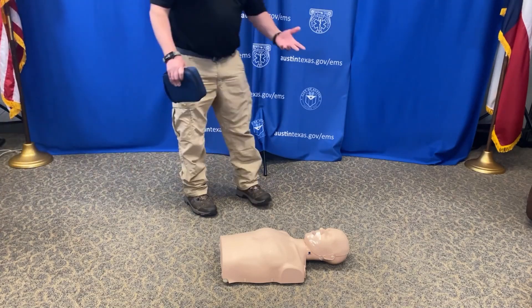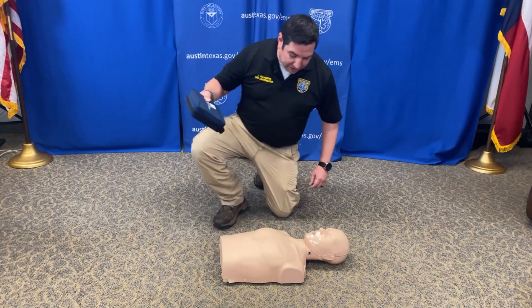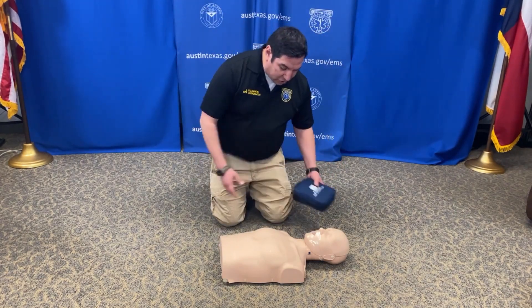All right, today we're going to go over hands-only CPR. Survey the scene — make sure that the scene is safe for you to enter. You're going to kneel next to your patient.